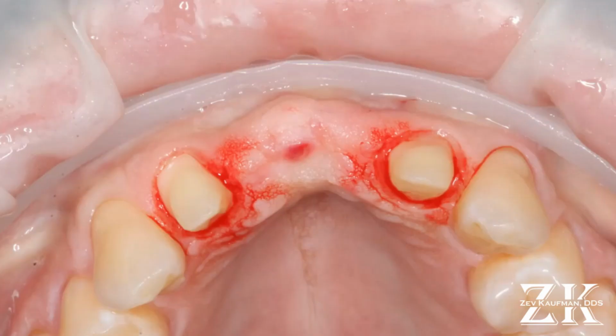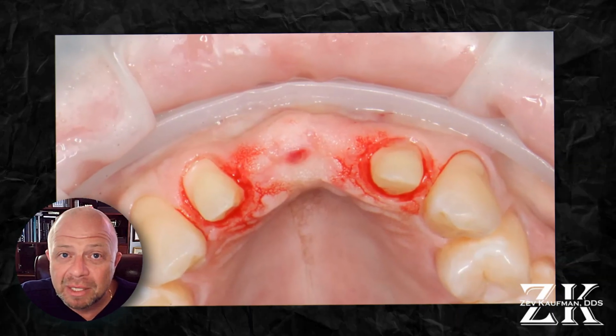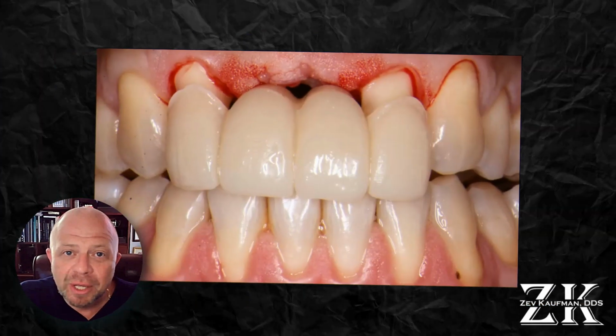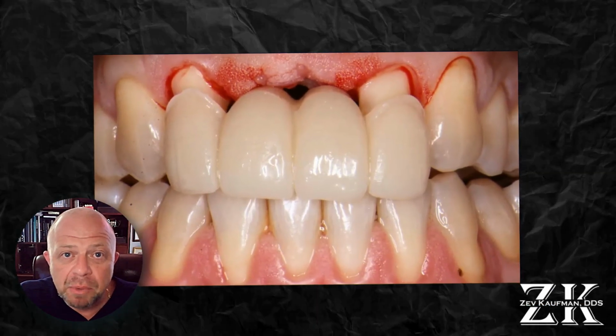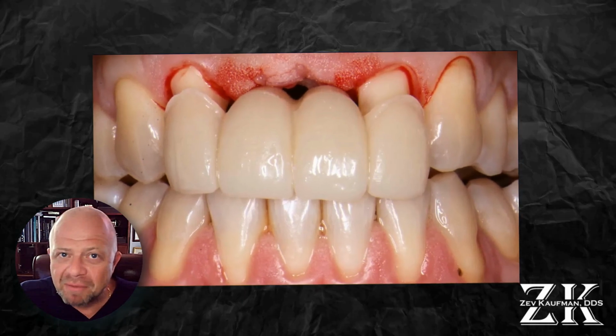And because this tissue is irregular, the bottom of the bridge will be irregular. If that is the case, my patient will never be able to clean underneath, not even my hygienist. Let's modify this so we can create a nicer environment that will not only look better, but function better. Let's take a look at this. My technician actually made me a bridge with ovate pontics. We've discussed this before, one of my favorite topics.